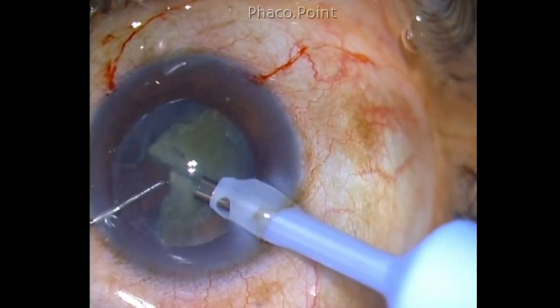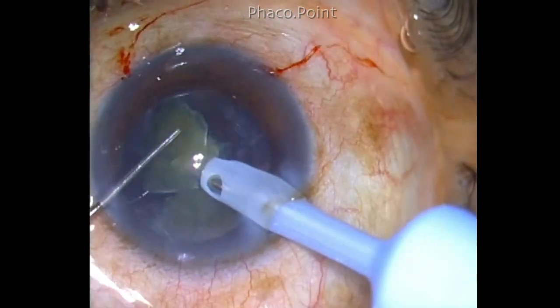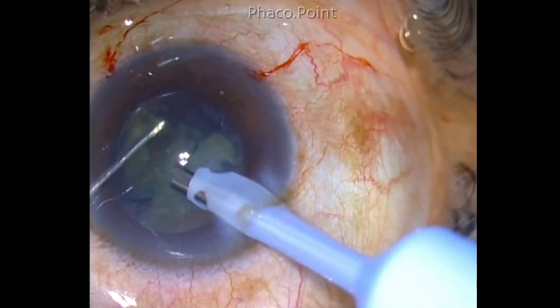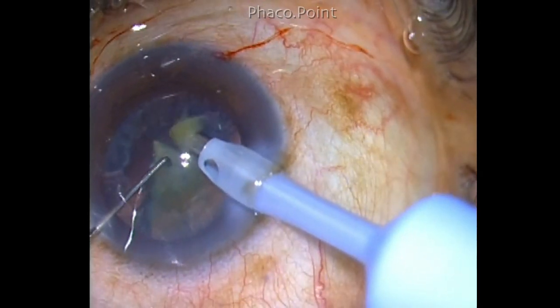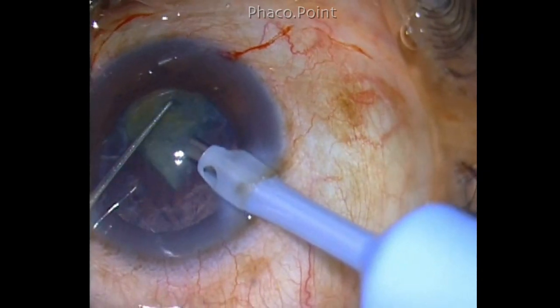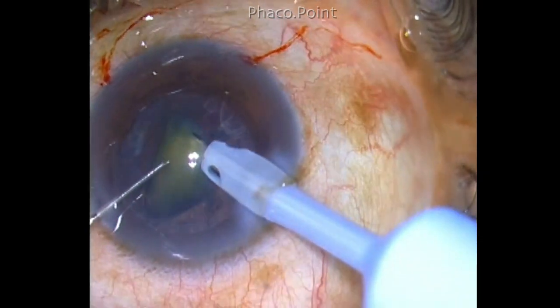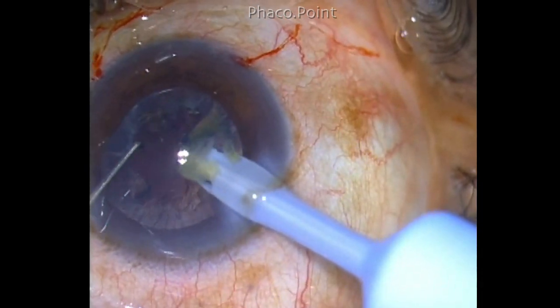So, one piece at a time: bring it to the central zone, emulsify it, make sure the anterior chamber is extremely clean and free of nuclear fragments before attacking the next fragment. In this way, keeping the phaco probe in the center — not chasing after the pieces — with intermittent application of phaco energy and phaco power, you are able to remove all the nuclear fragments.